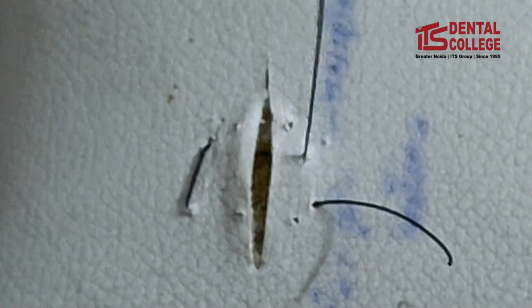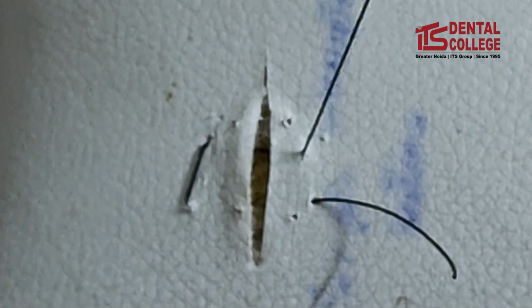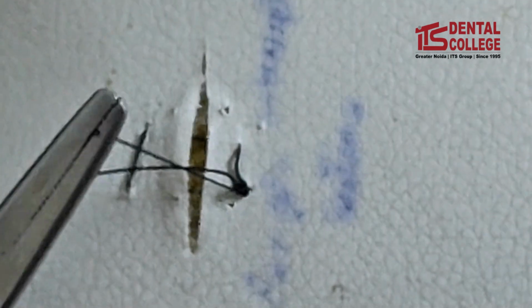So we have to keep in mind the incision distance, the distance from the incision on both buccal and palatal is same. And then we will tie a knot, 2 throws clockwise, square the knot, 1 anti-clockwise and 1 more clockwise. So this suture is called as horizontal mattress suture, and we will cut the excess suture.